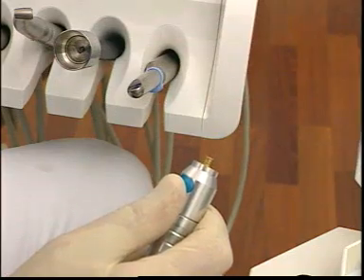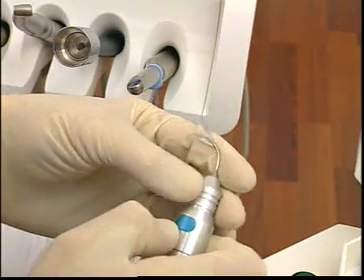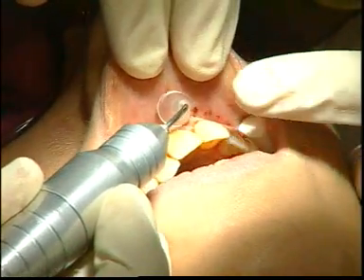Changing the fibre heads of the Aura laser jet is child's play. The integral soft laser is now used for post-operative treatment. Numerous already installed programmes are available to the surgeon or dental nurse.